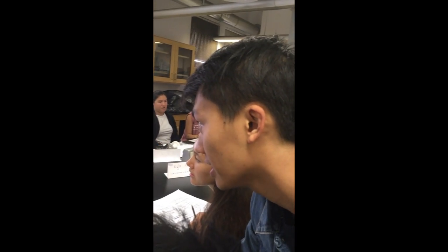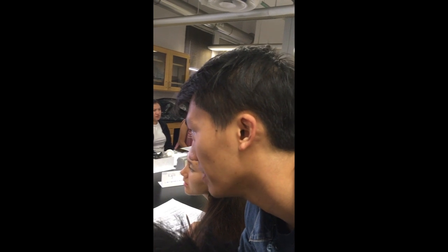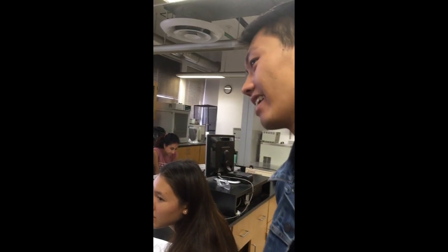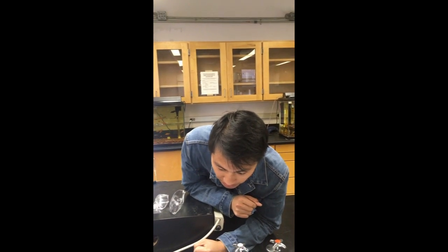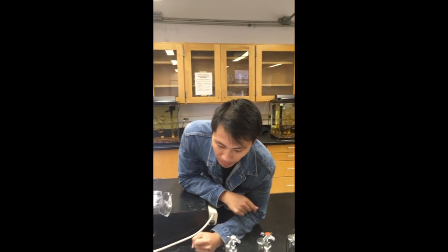I think it's important that you guys don't try to get only the grip in, because what would the problem be if you highlighted a bunch of zeros? Yeah, you're right. It messed with the statistics. So you guys get it? Cool. So that's the length of the entire wave, from the R wave to the R wave. R to R. Okay. I mean, I could just check.